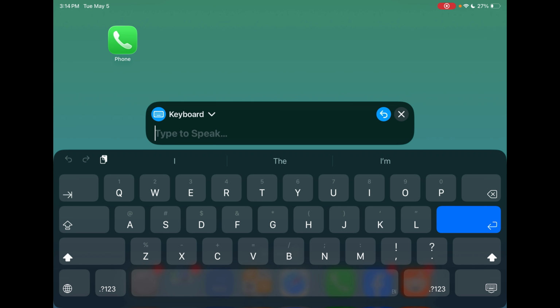years. In particular, adult AAC users often seem to really like those Siri voices and often are drawn to a particular one. There was someone over in a group today that was specifically asking about this voice. And so I thought it was cool that it's able to officially be used here in Apple's feature. There is a way in some AAC apps to kind of use a workaround to use Siri voices. There's not an official way. And I'll link an example to a video below.